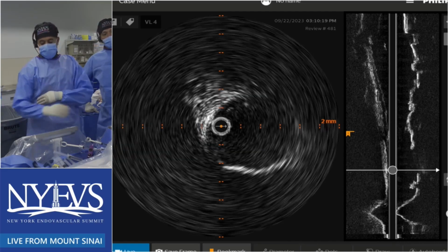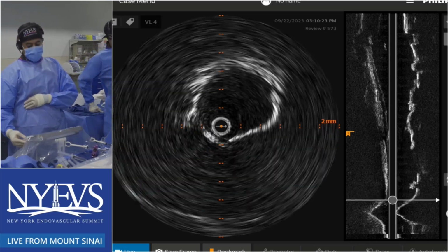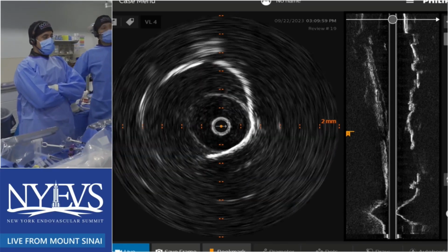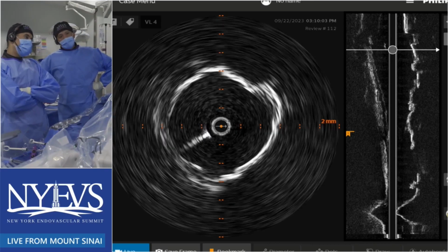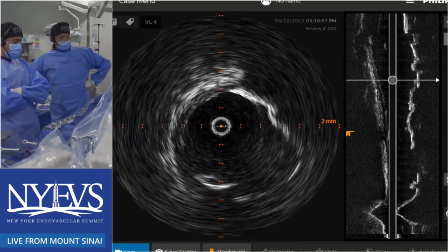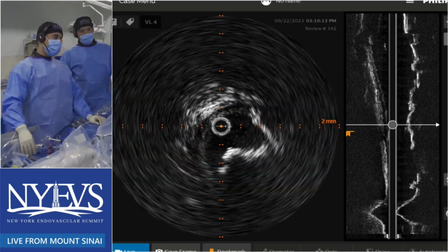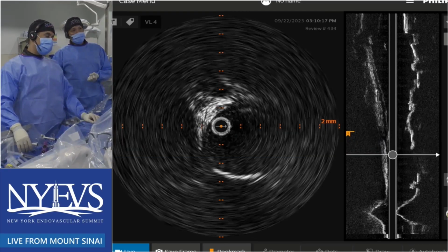Yeah. Right. The question is, we were very hopeful that we would go with bare metal self-expanding stents. So this is the post-IVUS image now. You can see the calcification. Do you guys still have any suggestions? This is biased in favor. So suggestions regarding the stenting technique? Would you stent? We used a 1-to-1, but would anybody have used a smaller size?